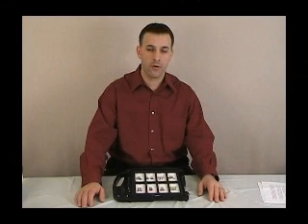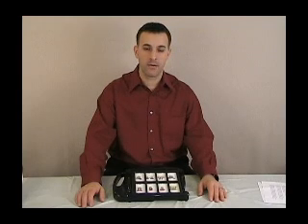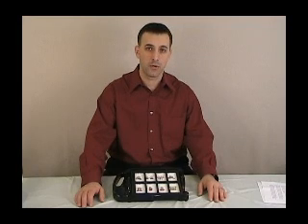And one important note regarding levels, when choosing a communication device, keep in mind that different communicators that do offer levels all have different amounts of level choices, where some may have more than others. So when making your selection, please keep in mind what the goals are or what the use is going to be for that communication device, and pick your device accordingly.